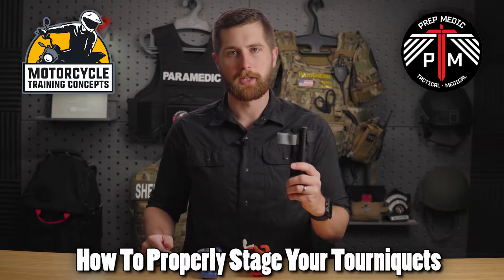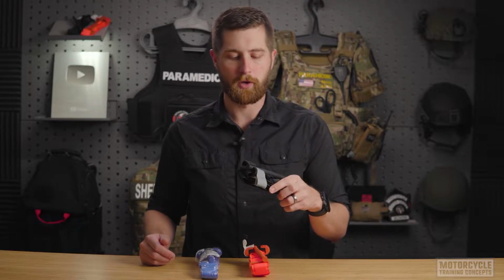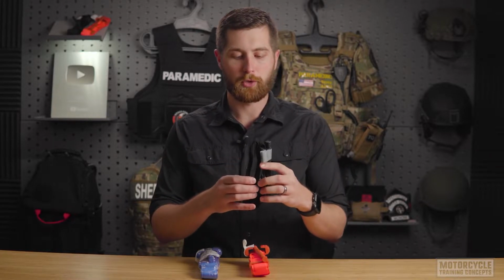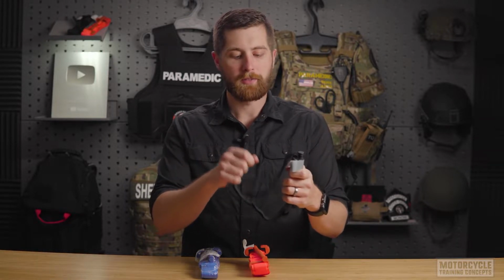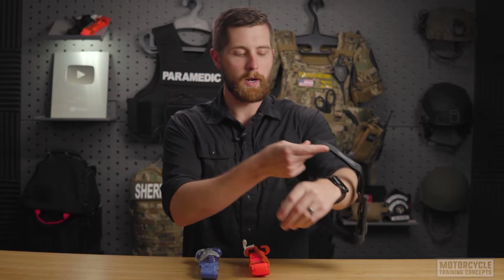to properly stage a cat-style tourniquet for rapid deployment. So this is super important because seconds count when we're putting one of these on a patient. There are two main ways to stage a tourniquet that I'm going to talk through today. The first way is the traditional way, and it's relatively easy to do. So when you have the tourniquet, it should be able to rapidly expand without having to fiddle with any Velcro, and easily applied with one hand.